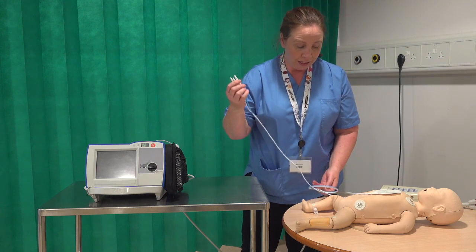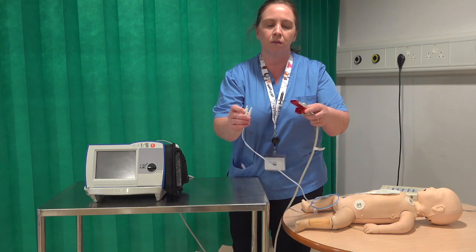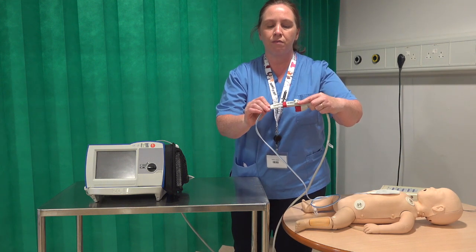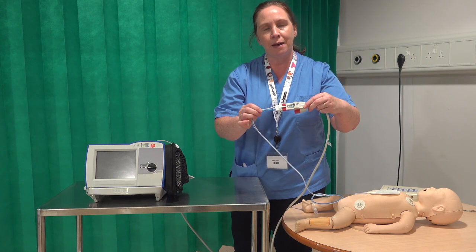The key thing then is that you need to attach this up to your adapter at the very end. The white cable goes into the long part of the red connector and it clicks into place — that's how your neonatal pads attach up.